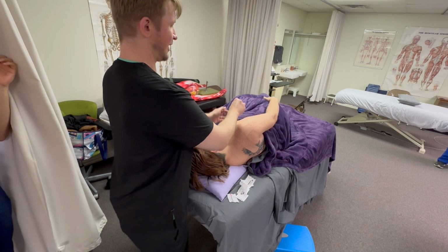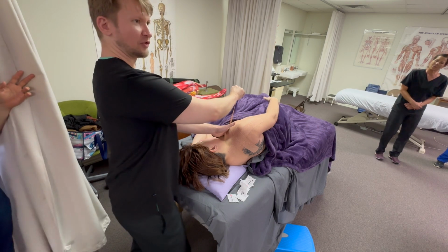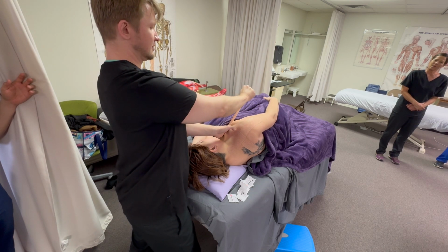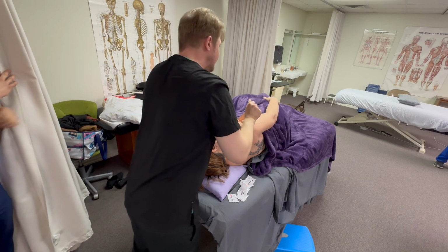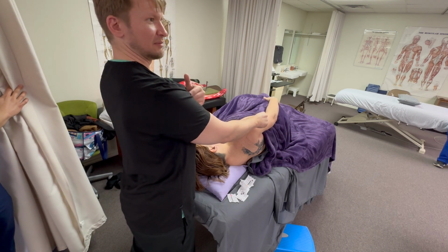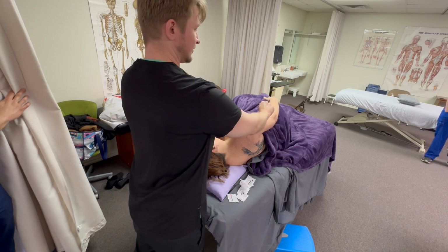So, now, the trick here is as I apply, I'm going to hold this on tension. Initially, I kind of hold the anchor down, so as I pull, I just don't suddenly take all the tape with me. So, pull, gonna press down, and then I start just navigating. I want to make sure I don't go across the seam here at the front, so I had to kind of walk it a bit that way. See how I'm kind of going to turn and just get it to go the other way.